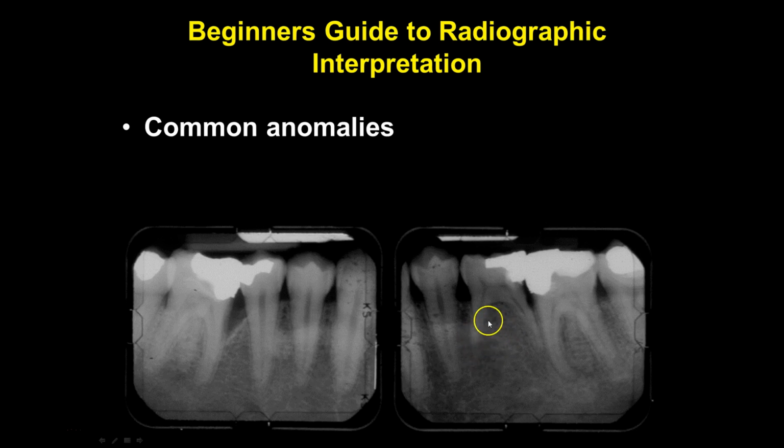So that brings about a real decision for this patient. Am I going to keep this for as long as I can? Do I need an implant? What do I need to do? Irregular discoloration, opacity in this region. And, oh my goodness, a 3-rooted mandibular molar. Very unusual. So you just never know what you're going to see.